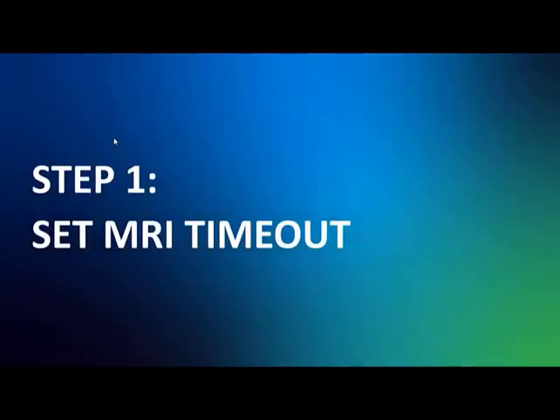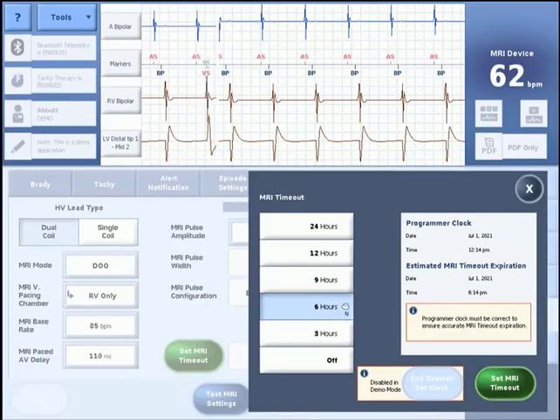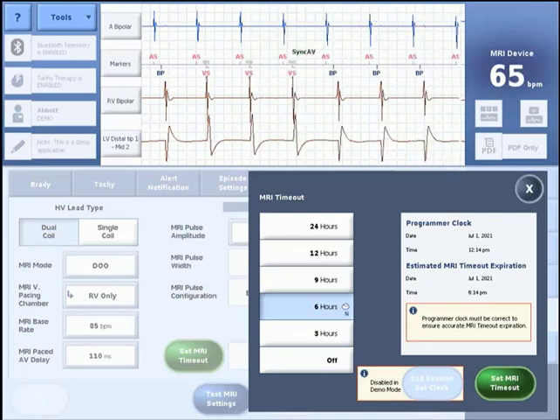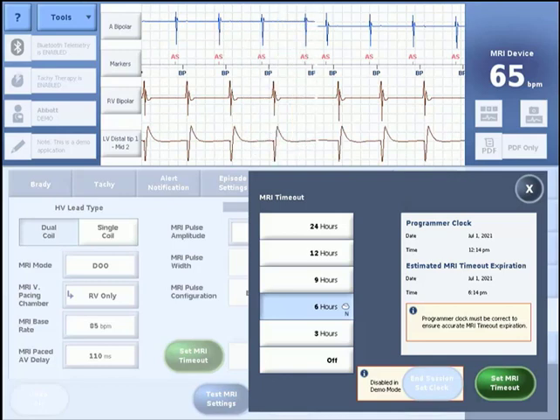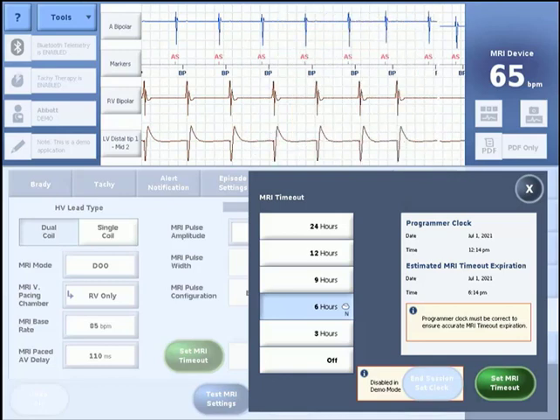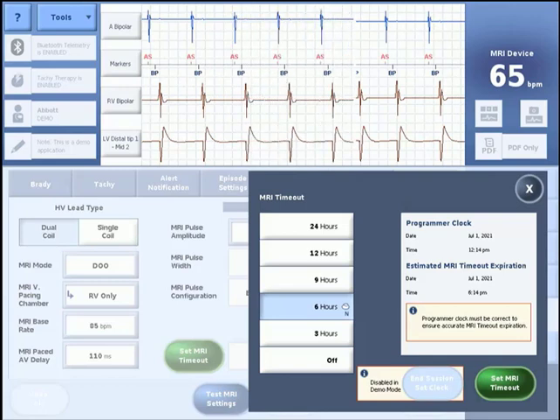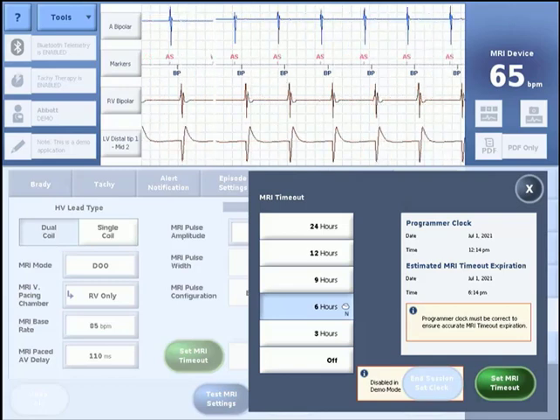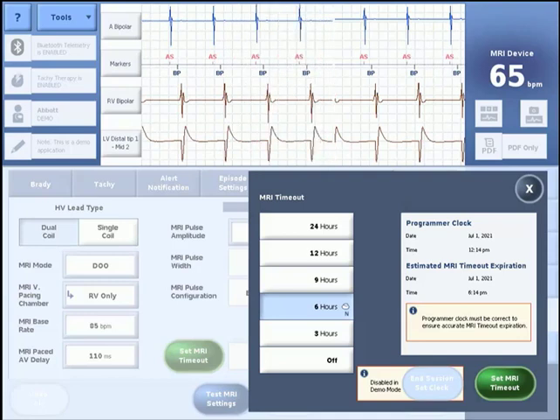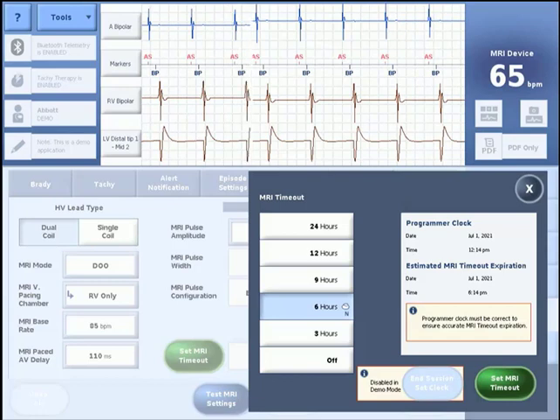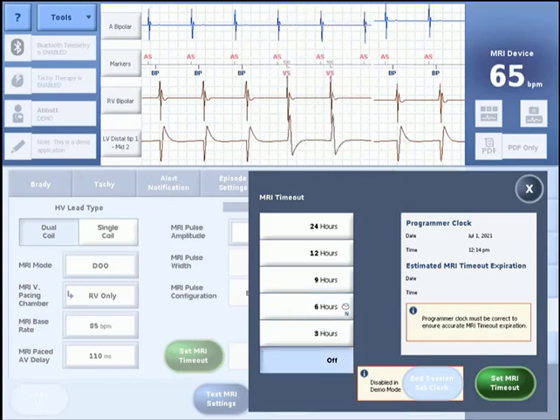The first step on the MRI settings tab is to make a selection for the MRI timeout feature by pressing the green Set MRI Timeout button. The programming options for MRI timeout can be seen on the screen, with six hours being the nominal setting. Note that the device will stay in MRI settings from the time Program MRI Settings is pressed until the MRI timeout expires. A value for MRI timeout is required prior to permanently programming the device. If no MRI timeout is desired, choose the setting option of Off.